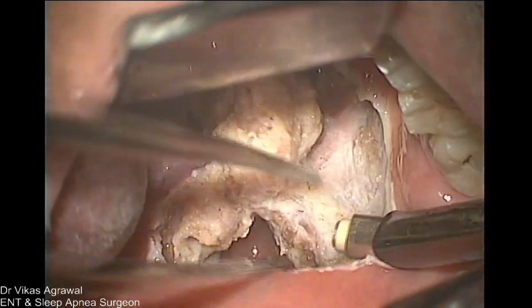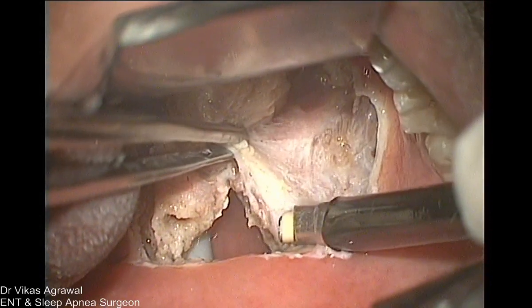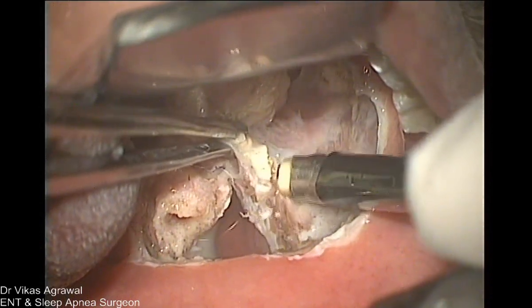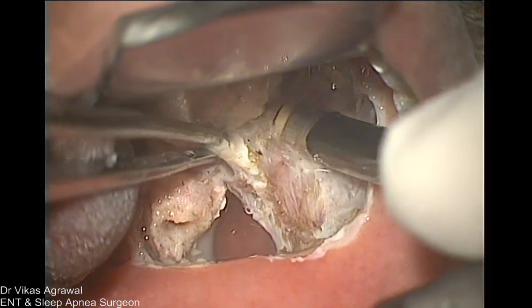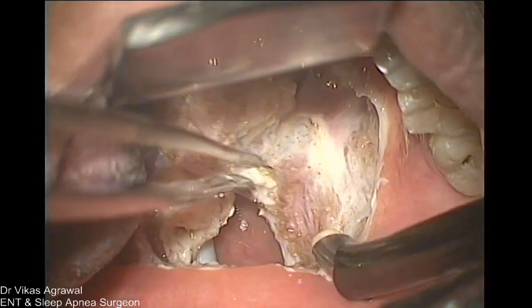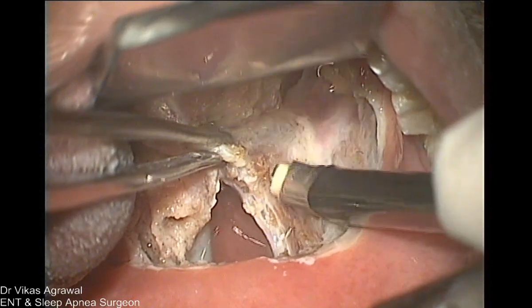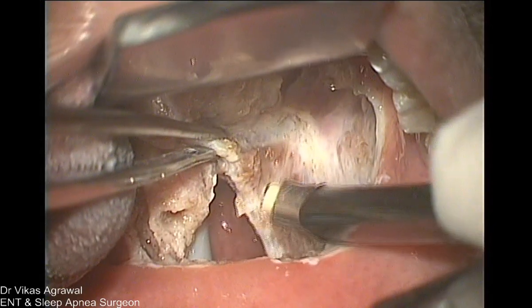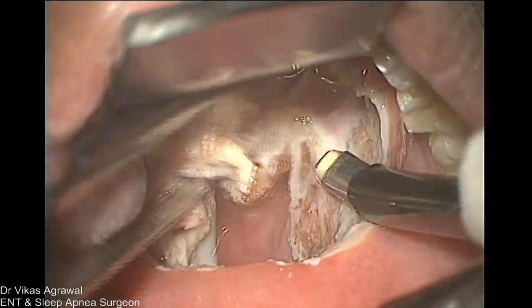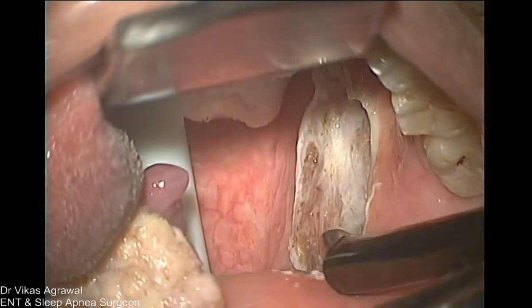These are the vertical fibers. These are the medial fibers. So this is my plane of dissection. Can you see them? So this is the vertical fiber. This is the oblique fiber. I'm cutting through all the oblique fibers, but not the vertical fiber. And that's it. Very cleanly you can see.